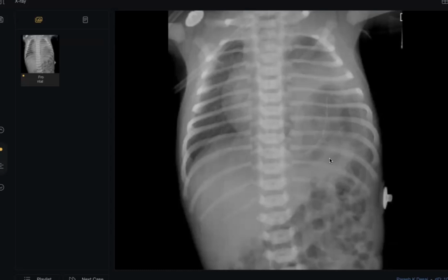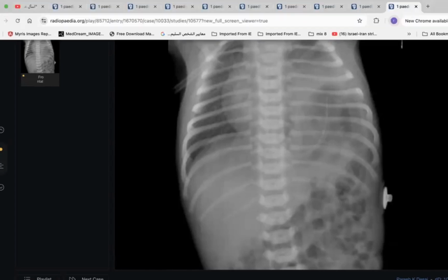Thank you, doctor, so much. Thank you, sir. My advice for all of you, when you see multi-loculated gas-containing pathology in general, have a look first at the stomach, have a look down. Can you detect the diaphragm or not? Is it continuous with the bowel or not? It will help you so much, my colleague, because there is a wide difference between a hernia and an infective process. Okay. Yes, sir. Thank you, Dr. Omer. Next.